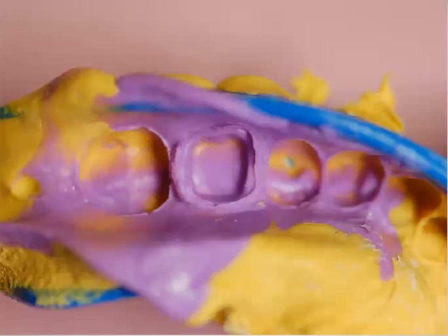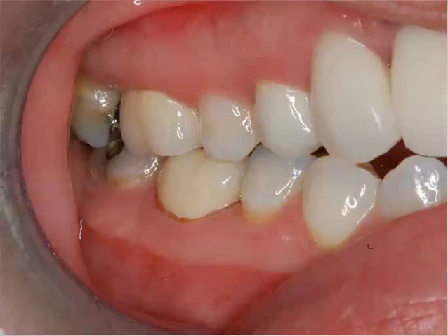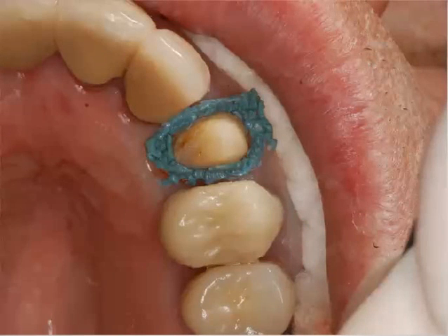You can see the density of that, a well-defined margin, well beyond the margin with our rounded chamfer, our rounded shoulder preparation, and it allows us the security of knowing that we've really captured everything we need and then some. And then just the final Lava crown in place. So a really nice way, you can see the nice marginal fit, a nice way of handling these situations, which is the workhorse of our clinical procedures, for our clinical cases.